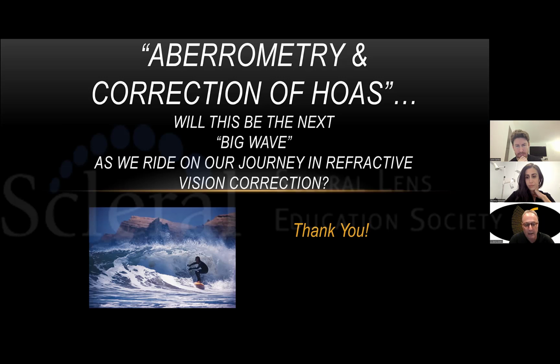There is really no way other than that in traditional sclerals, you're offsetting the anterior corneal aberrations from distortion, but the lenticular and posterior corneal ones, you're not. Just what it is.